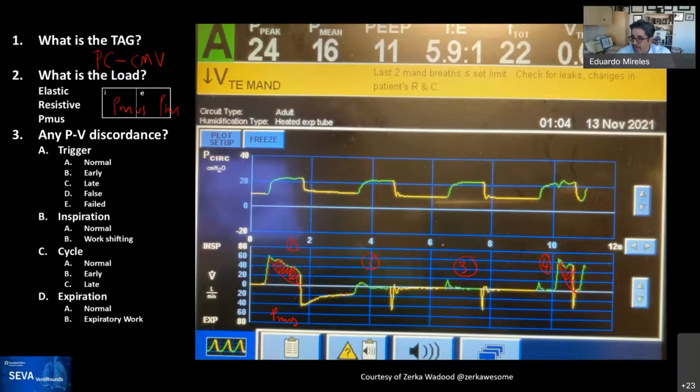Yes, Imran, the patient can generate as much PMUS to completely stop the flow in and out, without a doubt. Remember that the amount of pressure that the ventilator delivers, you can overcome that by PMUS. Not easily, but you can generate more than the ventilator does. And if you deliver the same amount that the ventilator is trying to deliver, there will be no flow.